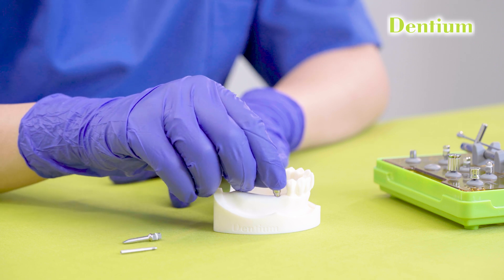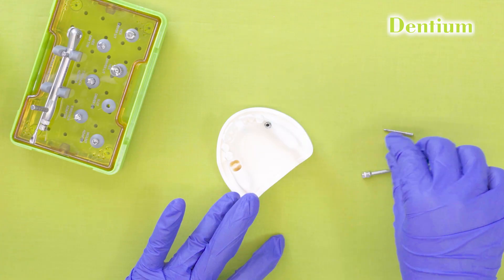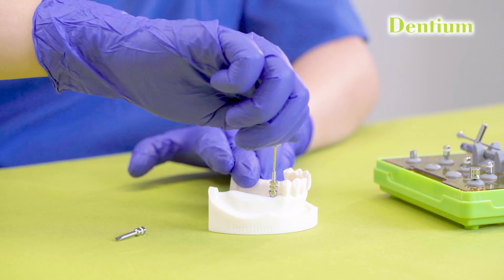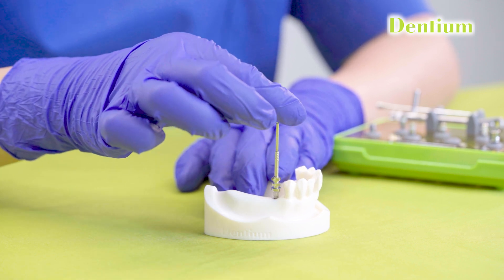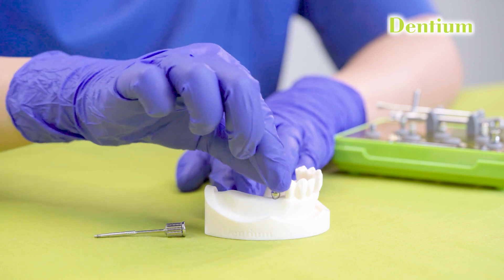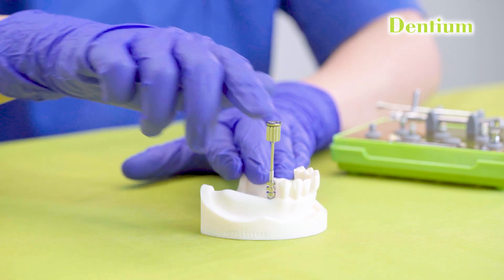Now seat the selected impression coping inside the implant and twist it slightly so that the hex of the impression coping is properly seated inside the hex of the implant. After that, the screw of the impression coping is tightened with the help of the hex driver. When in doubt, always take an X-ray to confirm whether the impression coping is properly seated. If after several turns the coping is still loose, remove the screw, slightly twist the impression coping again to properly engage the hexes, then retighten the screw. The recommended torque value for tightening the impression coping is 5 to 10 Newton centimeters, achievable by hand tightening.